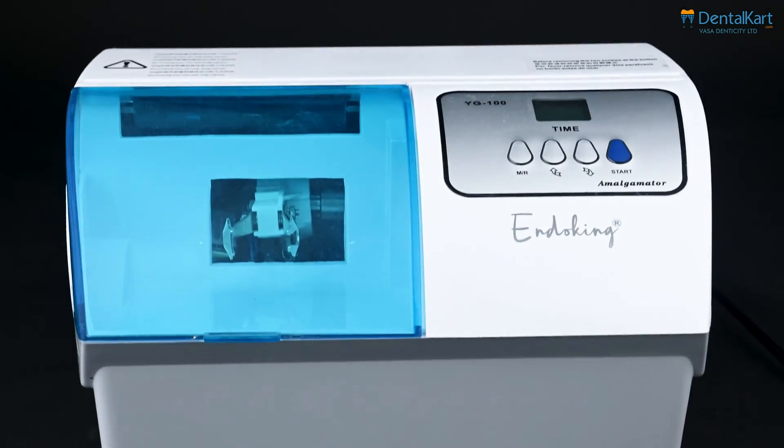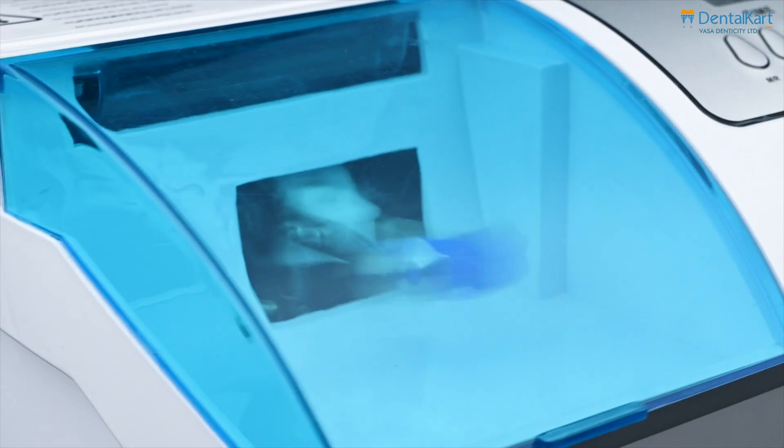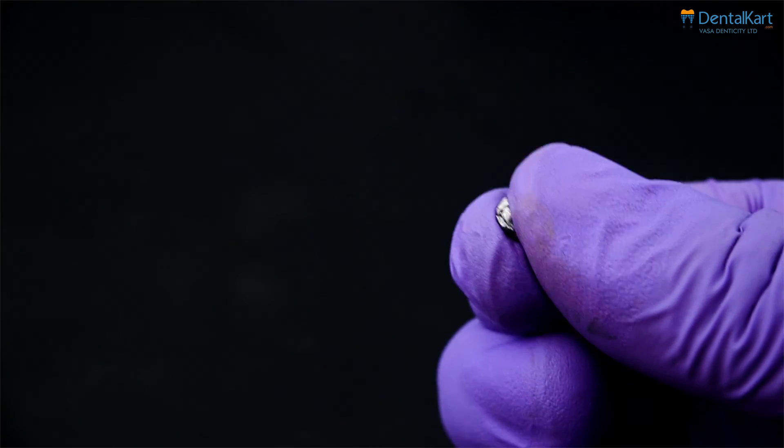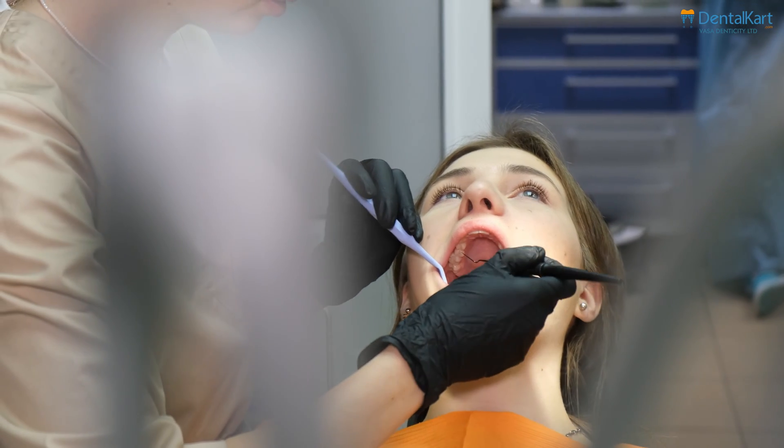The Endoking Amalgamator is an ultimate solution designed to deliver efficiency in restorative material mixing. It delivers smooth, bubble-free mixes, ensuring optimal patient outcomes.